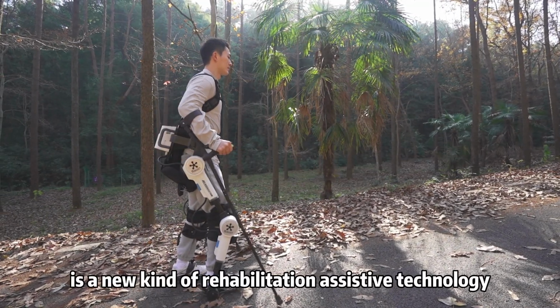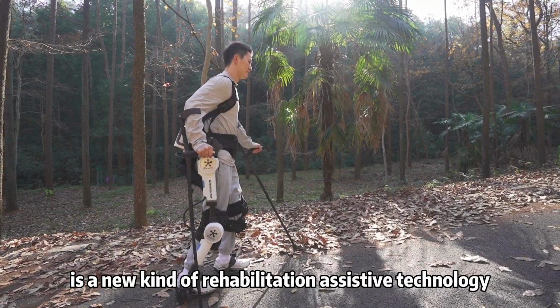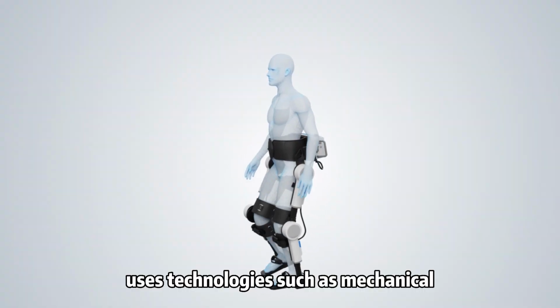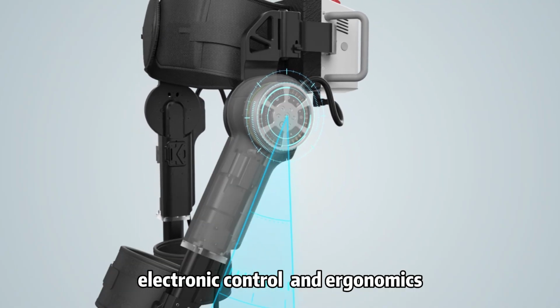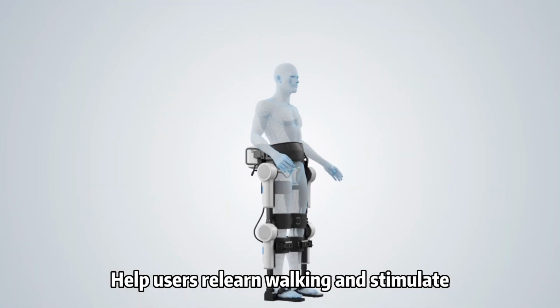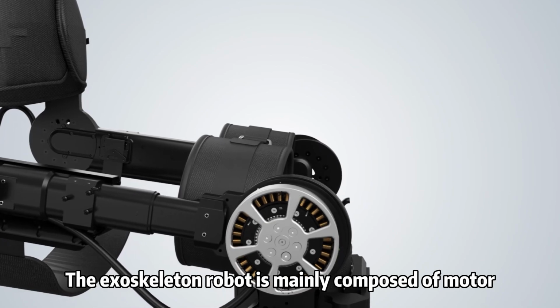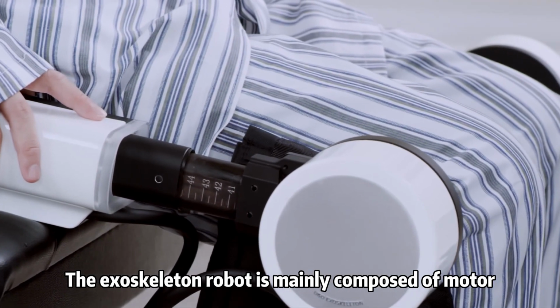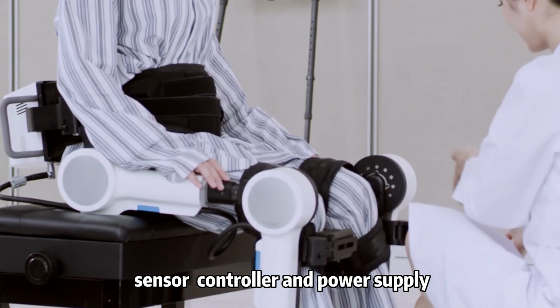Exoskeleton robot is a new kind of rehabilitation assistive technology. It uses technologies such as mechanical, electronic control, and ergonomics to help users relearn walking and stimulate neural reconstruction function. The exoskeleton robot is mainly composed of motor, sensor, controller, and power supply.